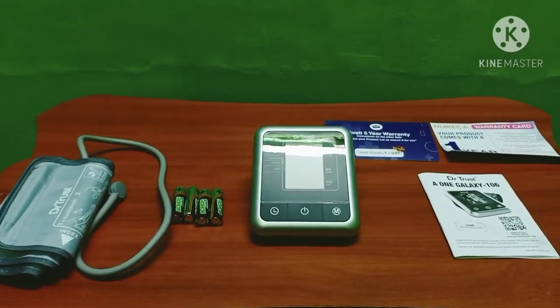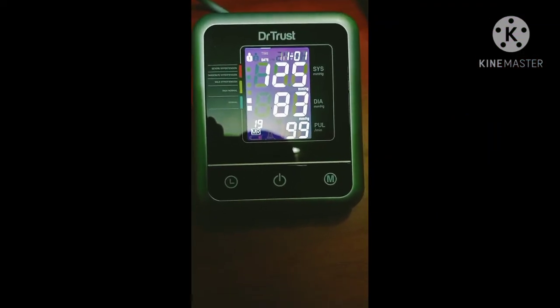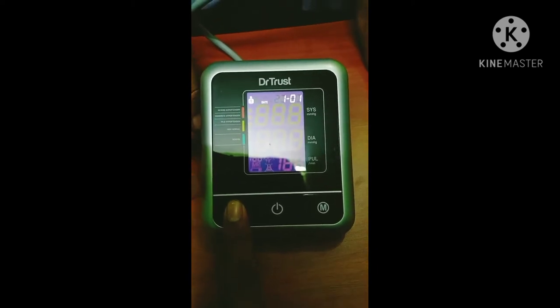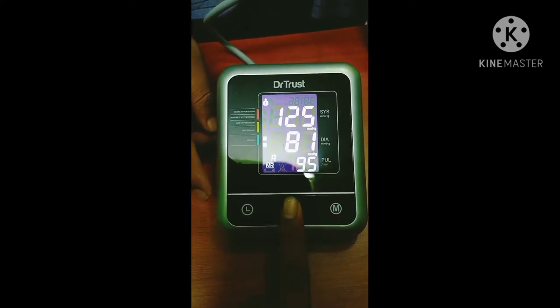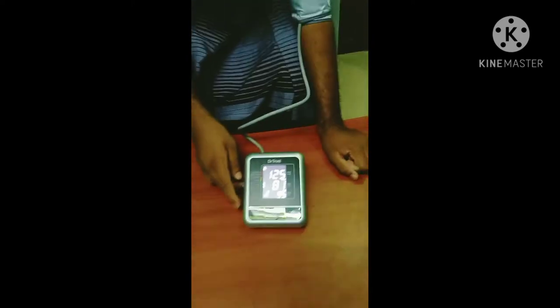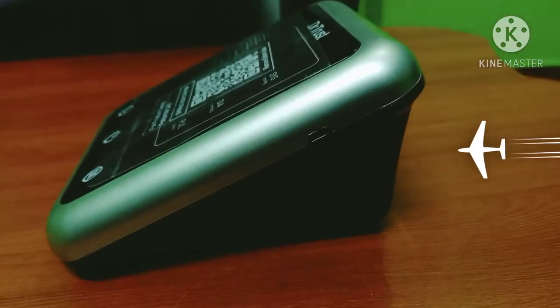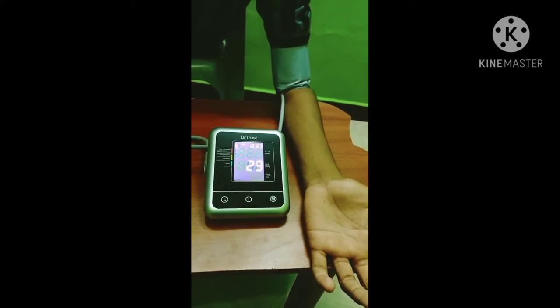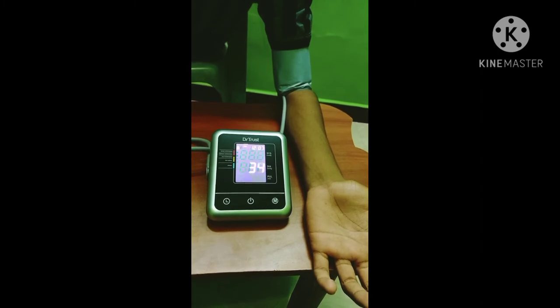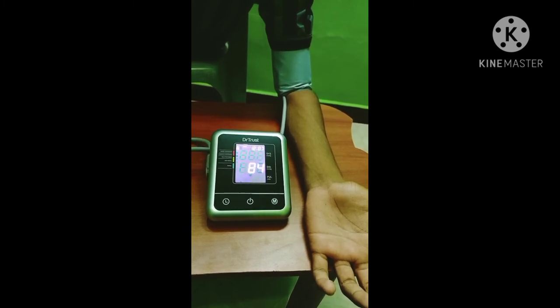The product has a good design. When you put the cuff on, press the button to start. There is also a USB charging cable included. I will now test the BP machine.